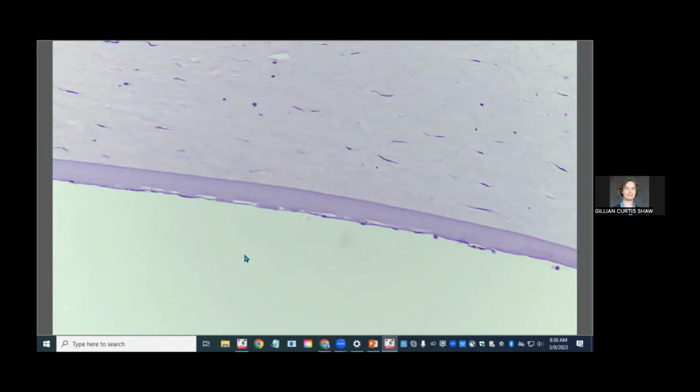It's very cool. The other feature that is very interesting in this case are these. If you follow the back of Descemet's membrane here, there are often these little bumps that project out. And so these are guttata, which in human corneal endothelial dystrophies, like Fuchs corneal endothelial dystrophy in humans, will have a very similar histologic appearance as this ringtail cat, which is just really cool. So this is another feature of corneal endothelial dystrophy.